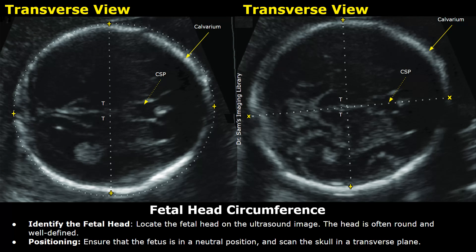Hello everyone, this is Dr. Sam, and today you will learn how to measure fetal head circumference on ultrasound. Fetal head circumference is one of the biometric parameters that is used to estimate the fetal weight and gestational age.